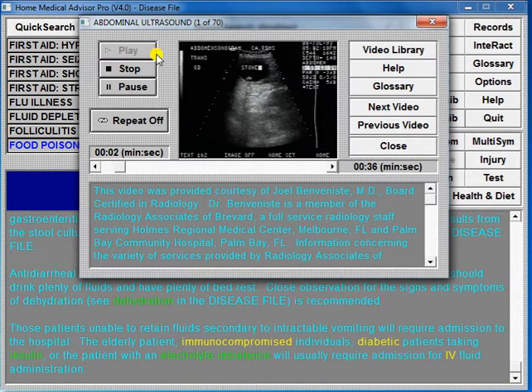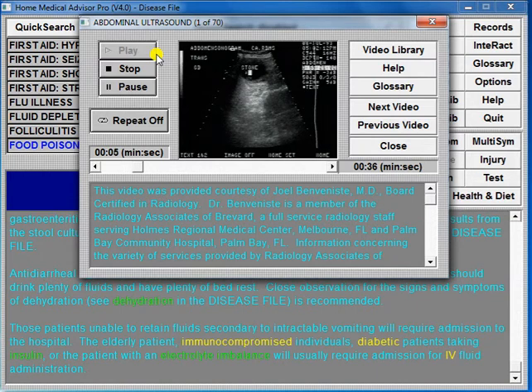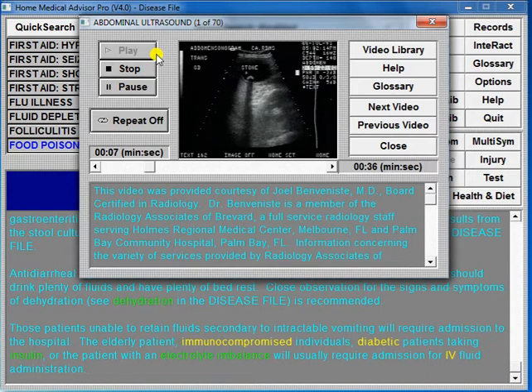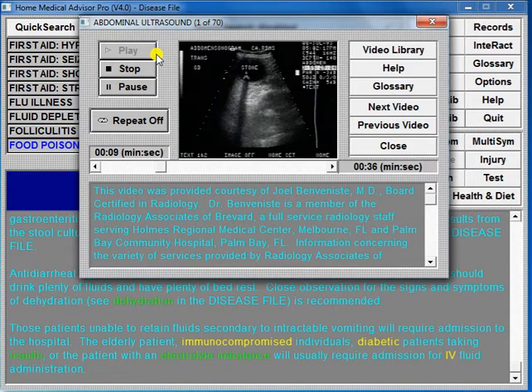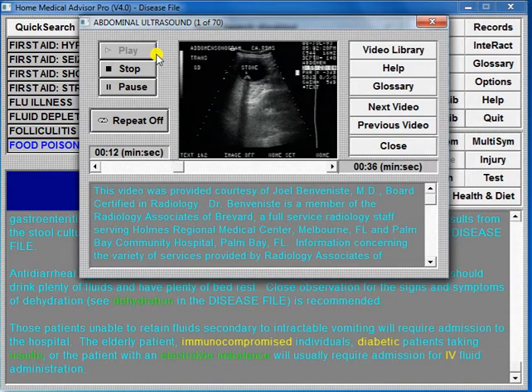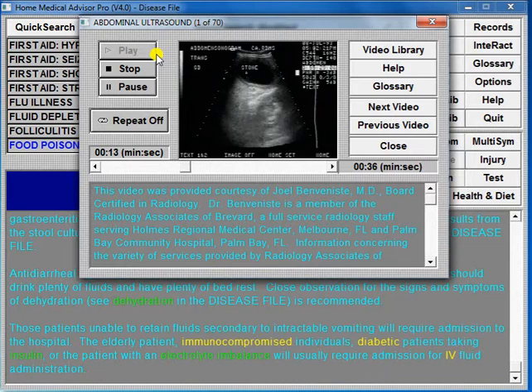Abdominal ultrasound uses high-frequency sound waves to generate an image of internal structures. Ultrasound is a useful non-invasive tool to detect gallstones, as shown in this patient.